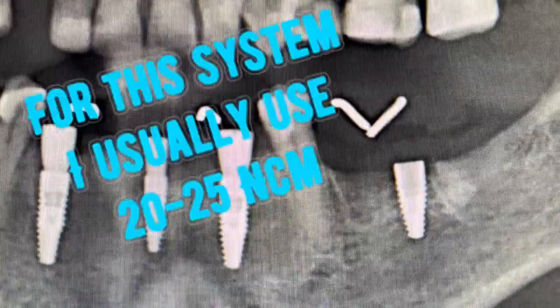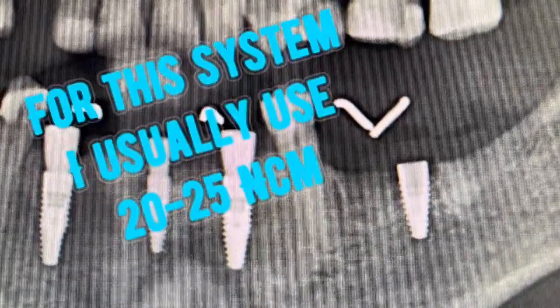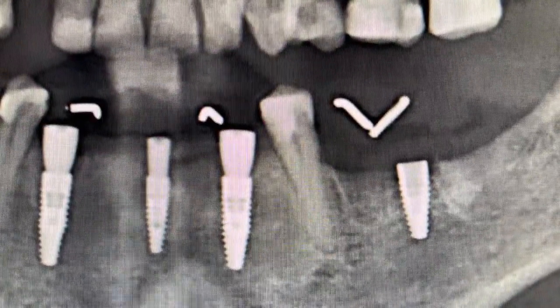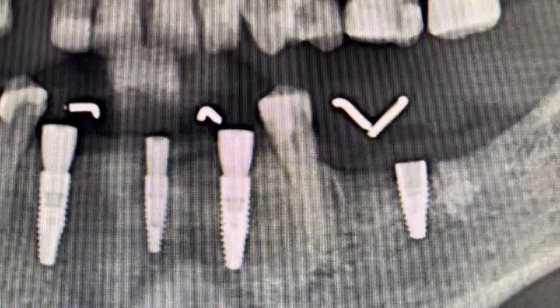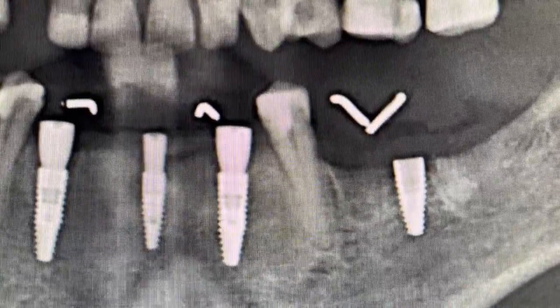That all depends on the different system you're using. Some systems have max insertion torques of 15 to 20 Newton centimetres, others of 30 to 40. But I would recommend using a torque wrench and taking it to at least its minimum restorative insertion torque to ensure that those healing caps don't become loose.